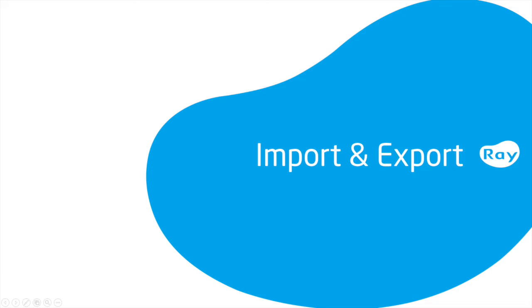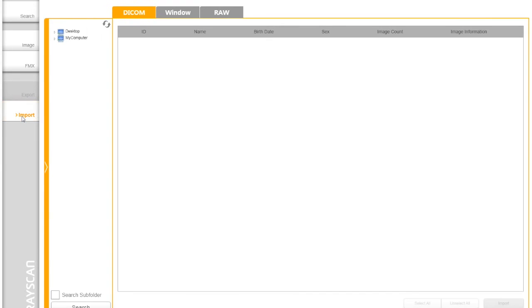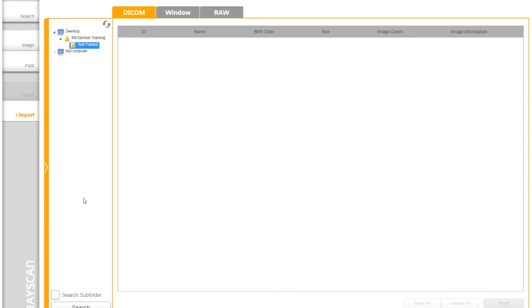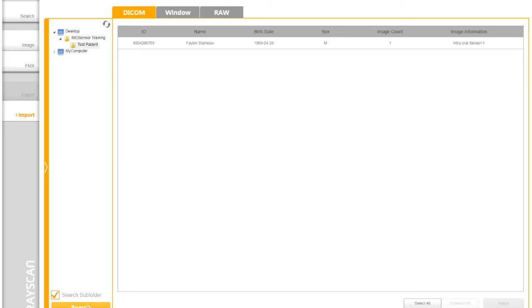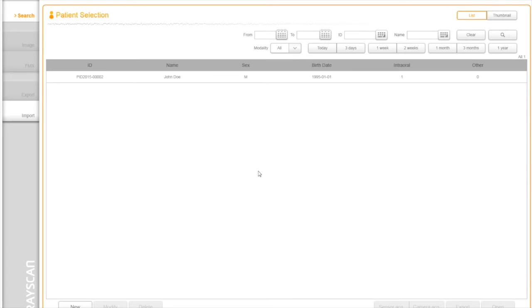Import and export. Importing images into SmartDent will allow them to be stored in the patient's record for future viewing. First, click on the import button and navigate to the location of the image. Click on the folder image inside and mark search subfolder. Then click search button. If you have more than one image to import, use select all button. To finish the import process, click on the import button.